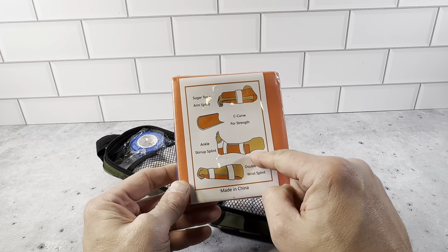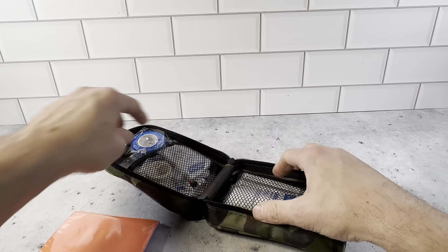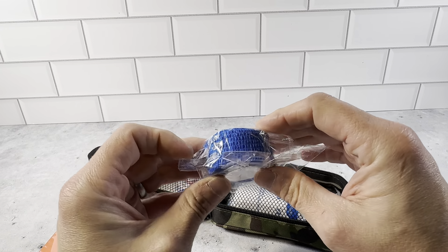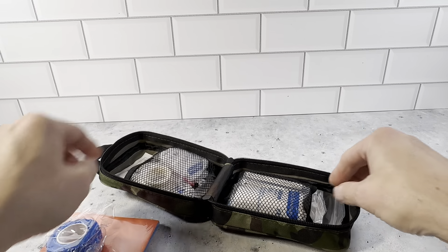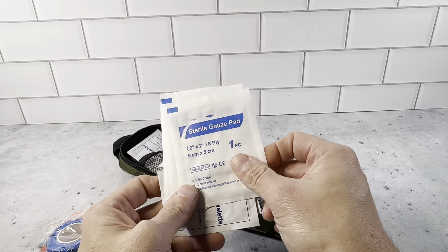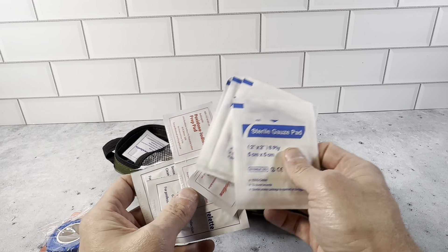Right here you have a splint. You could use it on several different things, but you have the splint. You have the tape right here, the bandages. This is a very inclusive kit — it's got pretty much everything you could think of. It's got the gauze pads right here, and you have several of those.